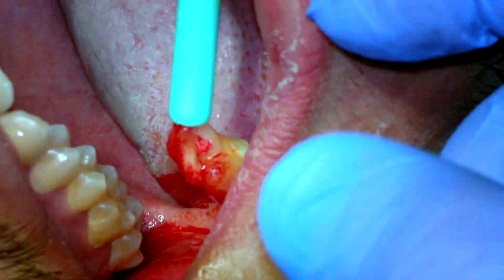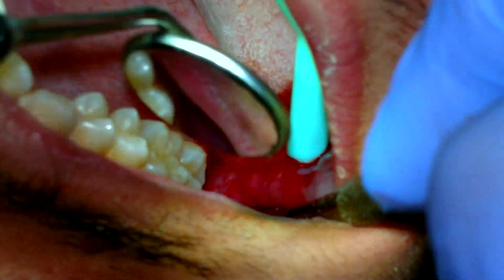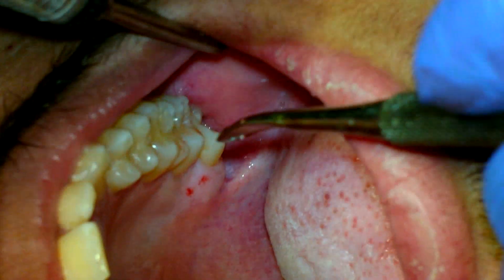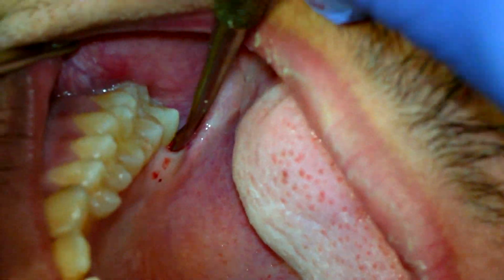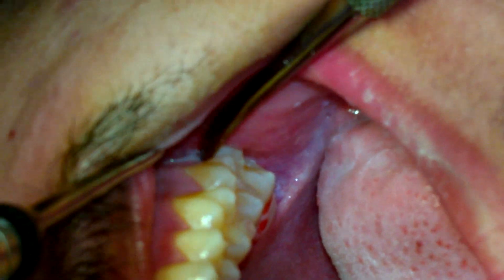So that's number one. As you can see, it has two diverging roots — maybe that's why it was not coming out that easily. I always check and make sure there's nothing left over. Now after 16. Any pain here? Good. Done with that one.